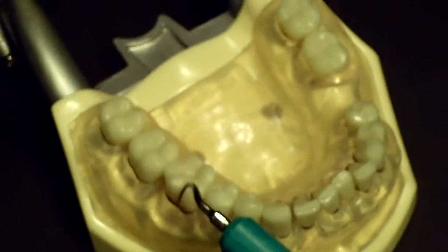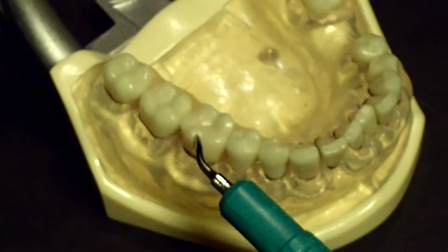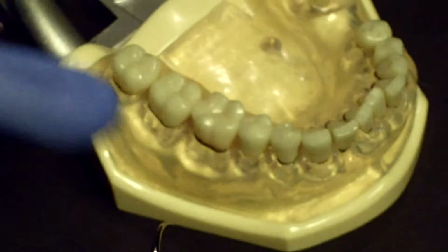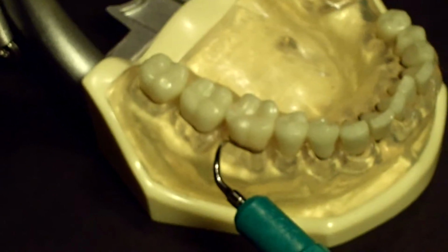So vertical approach is for our periodontal pockets. And this is how we tell we have the correct insert, because the back is against the tooth as far as where you're entering.